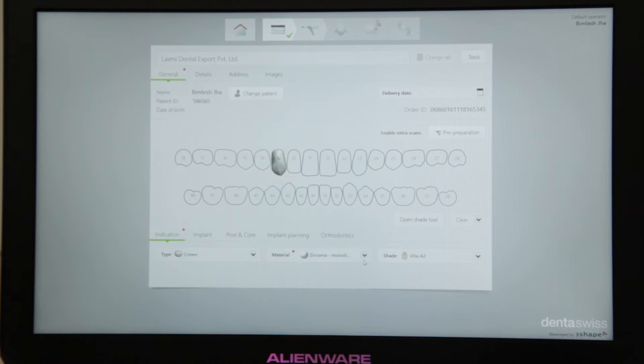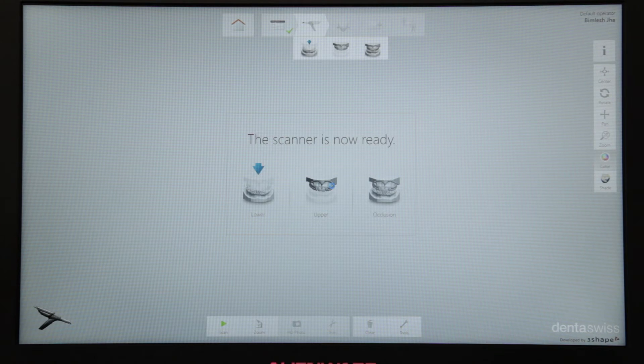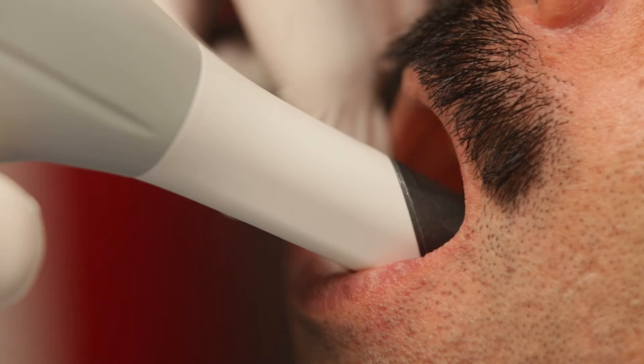This scanner can be used not only for crown and bridge, but also veneers, inlays, onlays and implants can all be scanned with it. Next, I am going to start scanning the arches, starting with the lower arch.